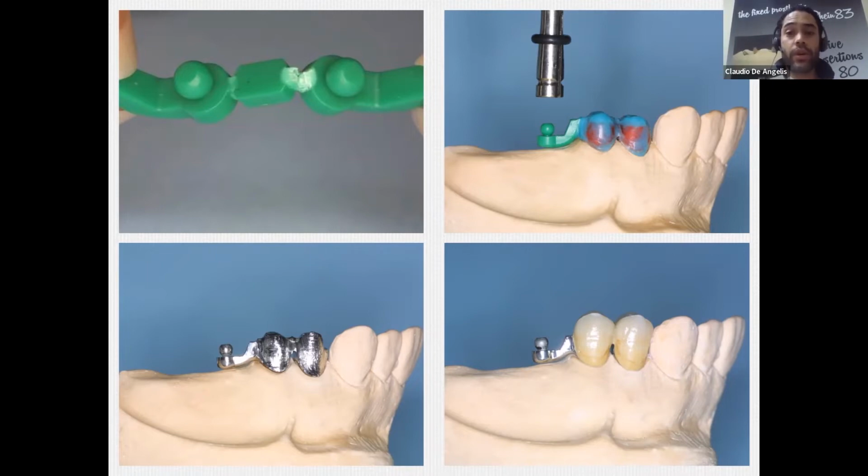You place your attachment on, again, both sides of the maxilla, in parallel between them and perpendicular to the occlusal plane. This is a very important thing to remember. You always need to investigate the occlusal plane of the patient.